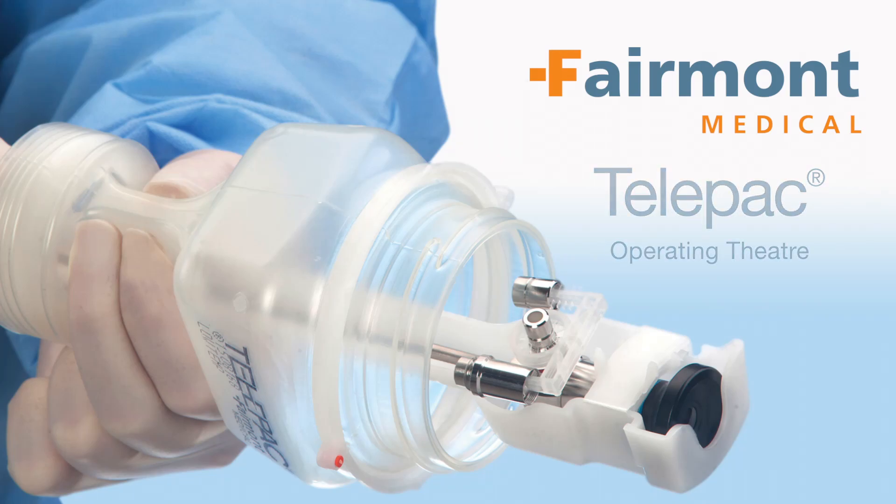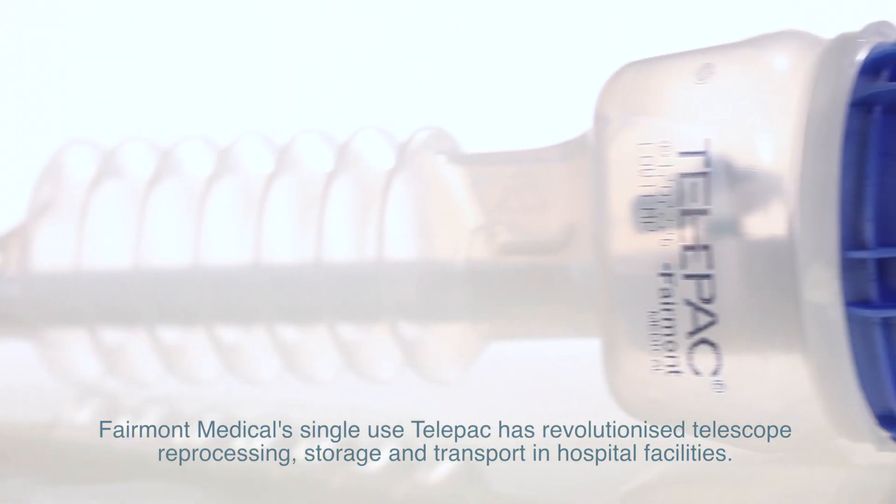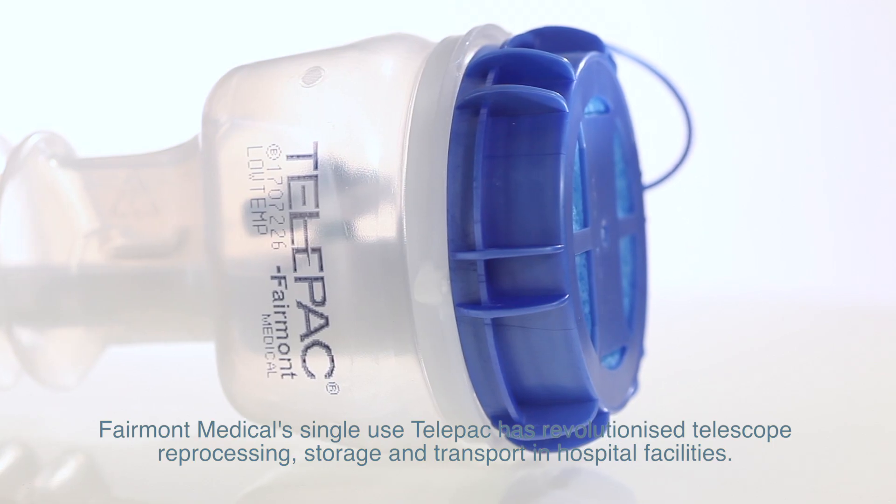Fairmont Medical's single-use Telepac has revolutionised telescope reprocessing, storage and transport in hospital facilities.